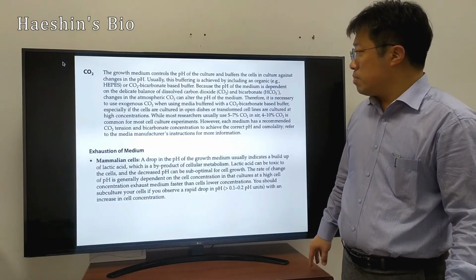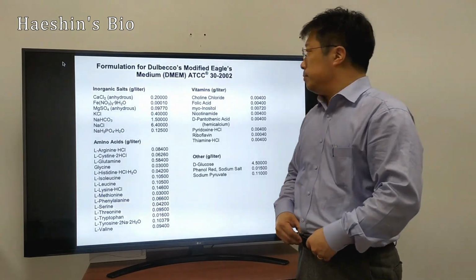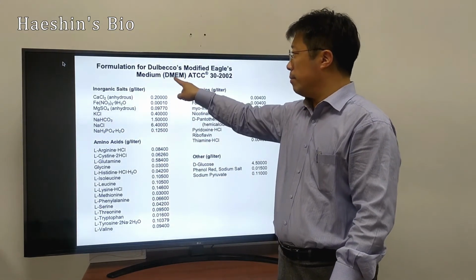And so I will show you the general compositions of the media. We call this DMEM or MEM.